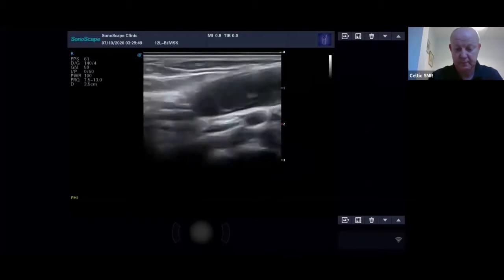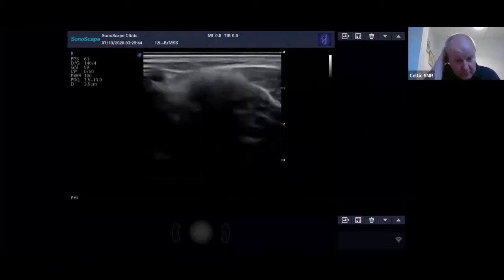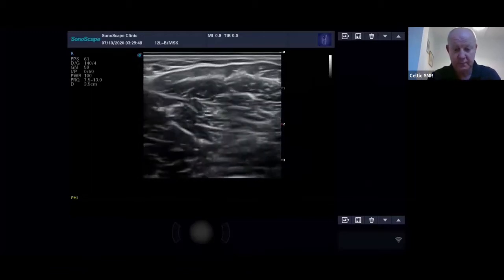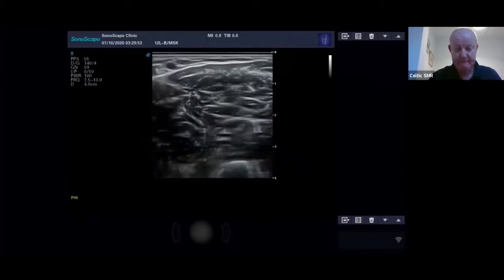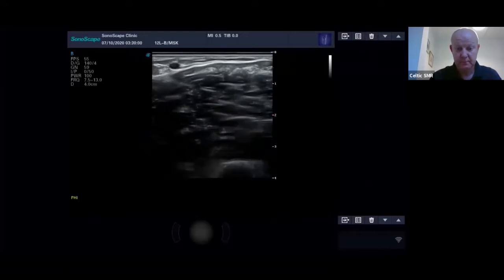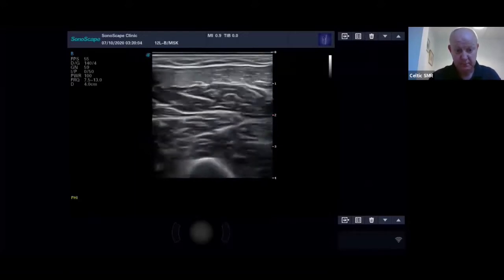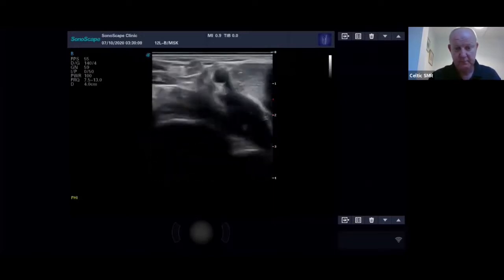Can you just show the controls again? I didn't quite have the camera on it. Which controls were you manipulating to optimise your image? So, you've got the depth here. That alters the depth. And then the focus is actually on here. And that alters the little red marker at the side of the image. And you want that pointing to where you're looking at. Every machine is, of course, different, but they all do have these same buttons and features.